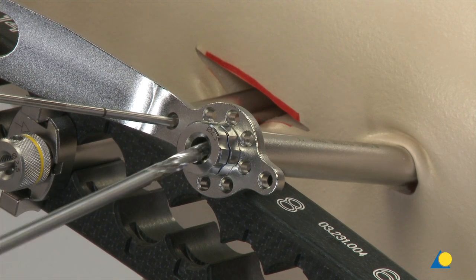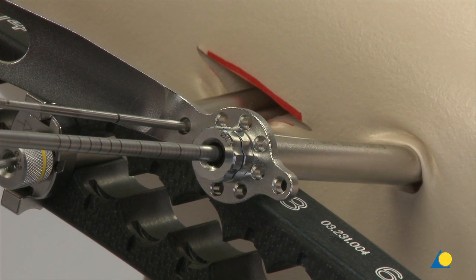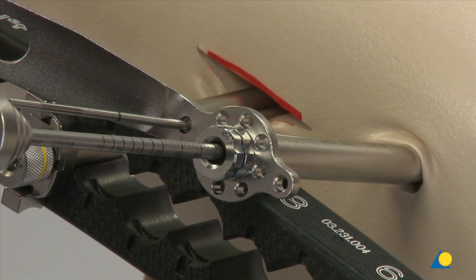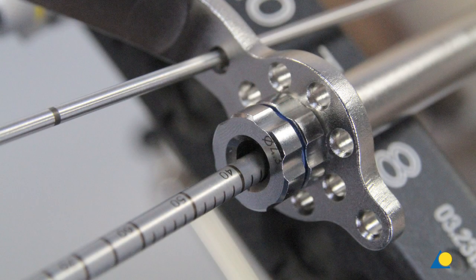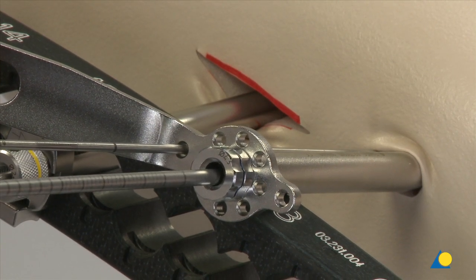Insert the 4.3 mm drill bit through the variable angle drill guide and drill to the desired depth. The positioning of the drill must be controlled under image intensification. Determine screw length from the drill bit calibration at the top of the drill guide. Remove the drill bit and the drill guide.